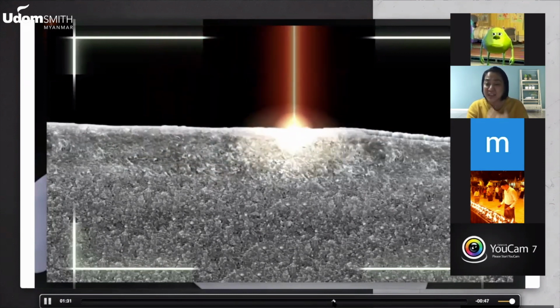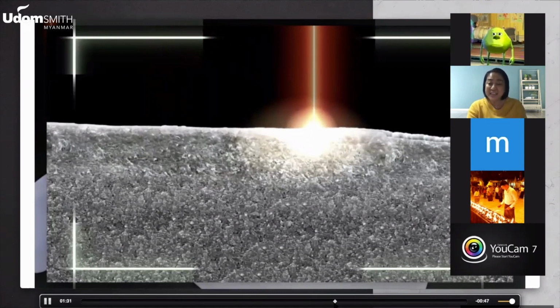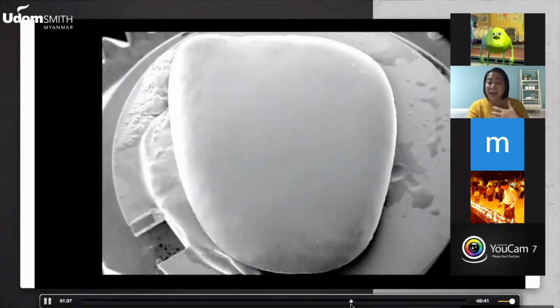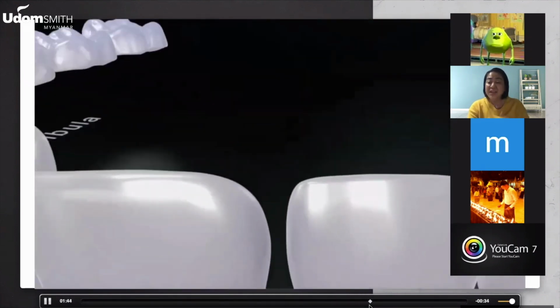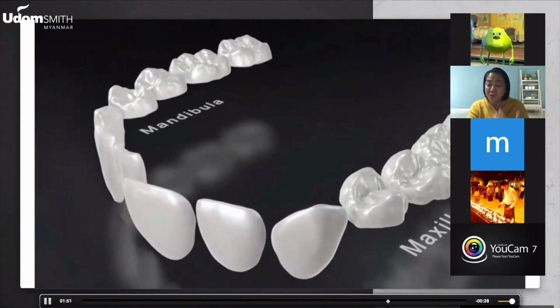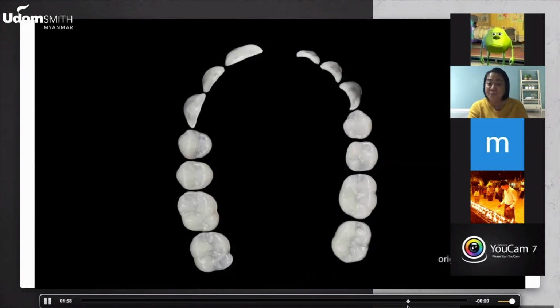So this is the misconception of a lot of dentists. They think that Edelweiss is composite resin because it came from composite. It is true, it came from composite, but the end result after the technology was applied to Edelweiss, it is now laser sintered vitrified glass. And because the majority of the resin is removed, this one will not stain, precisely because it is now purely or majorly made of glass, and glass is normally the one used by composite manufacturers as a filler. So it is not anymore composite once it is done.